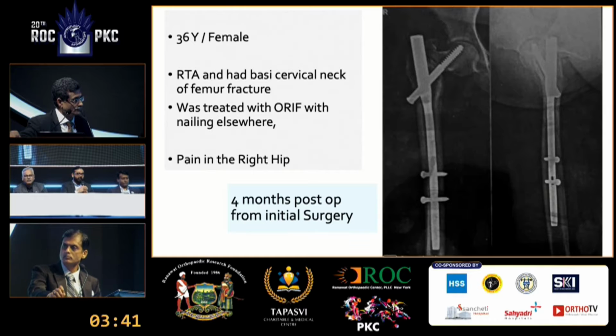On a 36-year-old, if the osteosynthesis option is completely out, since the trauma people don't want to take it up for osteosynthesis, I will also go for total hip. My implant option will be again distal fitting kind of stems.